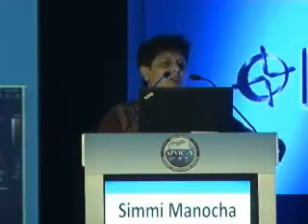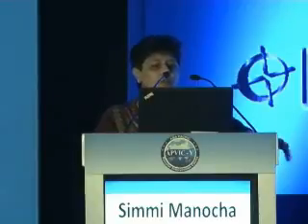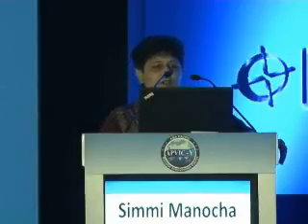So this is when you start doing a Doppler, you know how to put the color Doppler and what information you can gather. And normally, to get a good color Doppler, you have to see that the color fills the entire vessel or chamber of the wall.